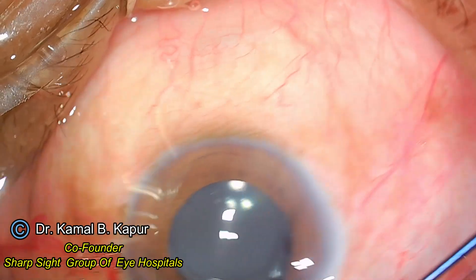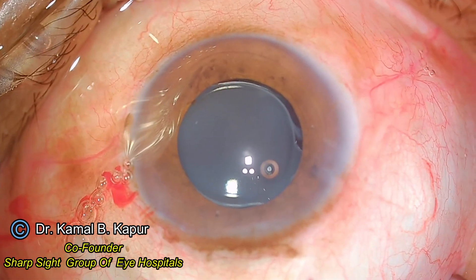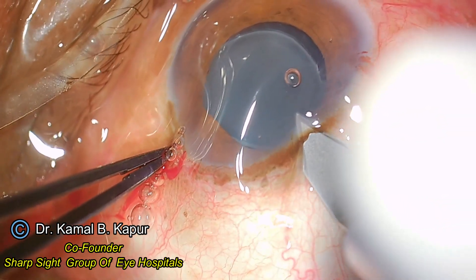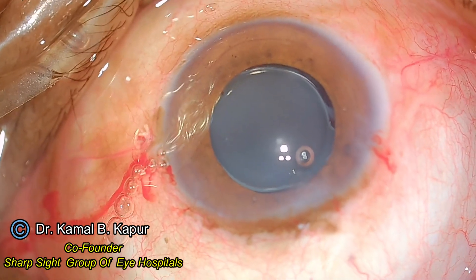I push in more viscoelastic and decide to change my approach, going from the main incision to try and get the IOL out of the bag.